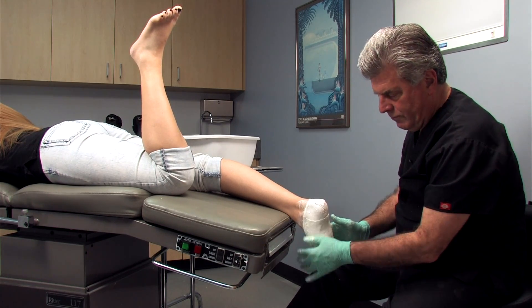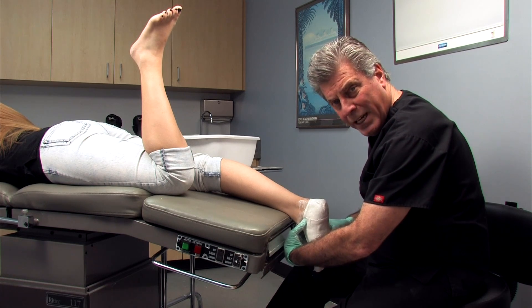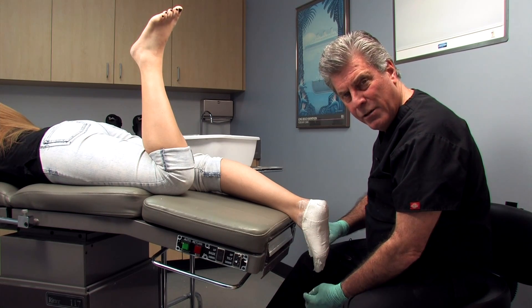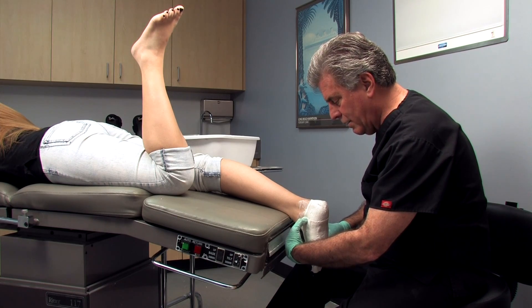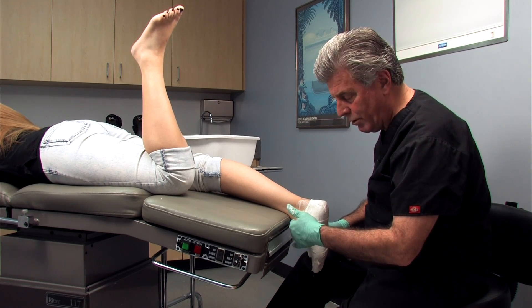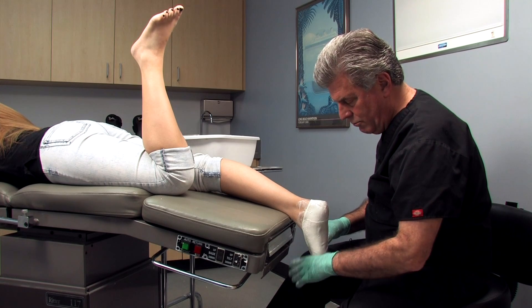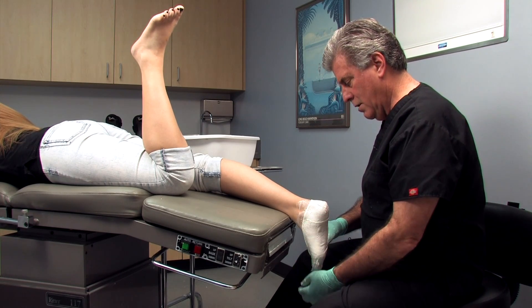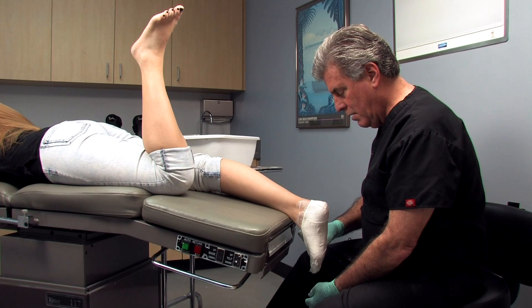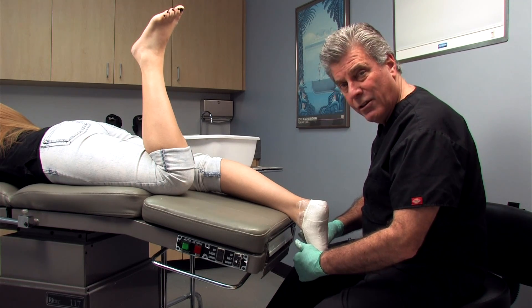Now we're going to position the patient. We palpate just like we do during a biomechanical exam to find subtalar neutral. We push our thumb right against the bottom of the fifth metatarsal head and push up to lock the mid-tarsal joint. When we do that, we want to feel up here and make sure the tibialis anterior is not prominent — make sure they're not supinating their foot and are staying relaxed. One final mold of the plaster, holding and pushing against the fifth metatarsal, loading the mid-tarsal joint, and letting the plaster cure. You might also want to pull gently down on the top of the first metatarsal to assure they're not supinating their foot.